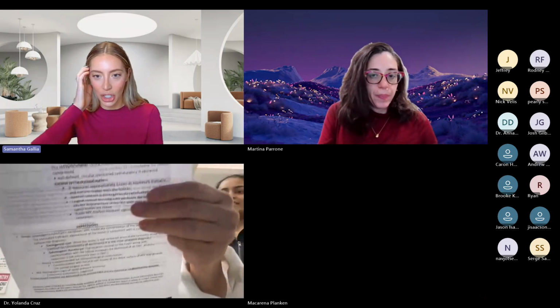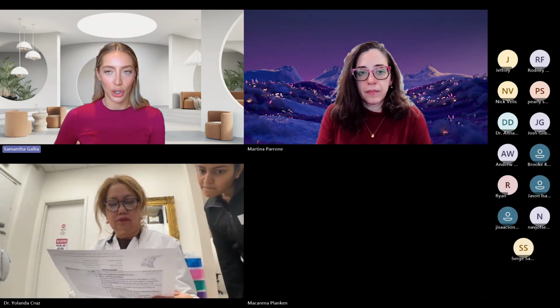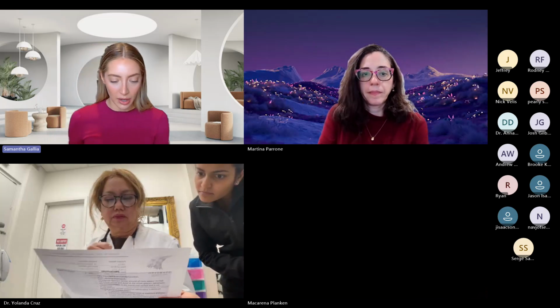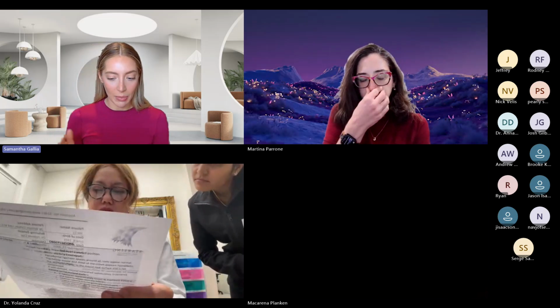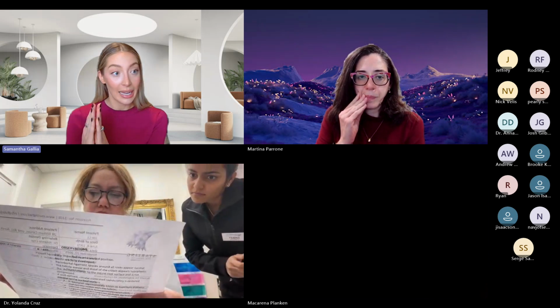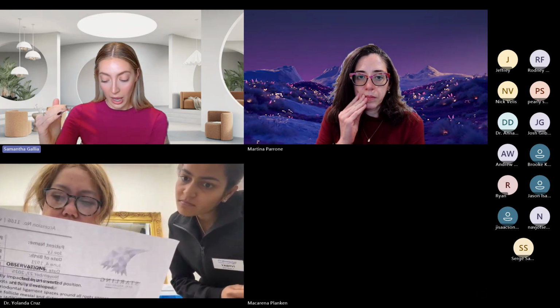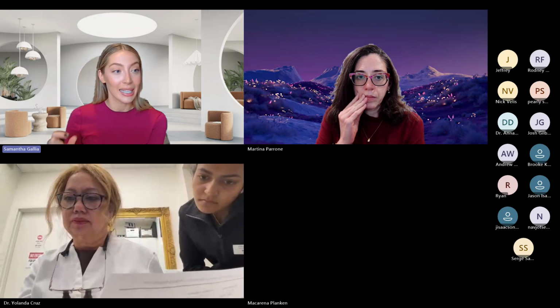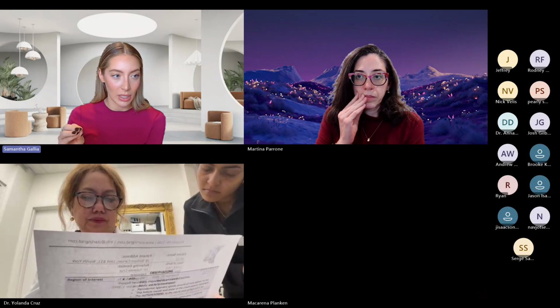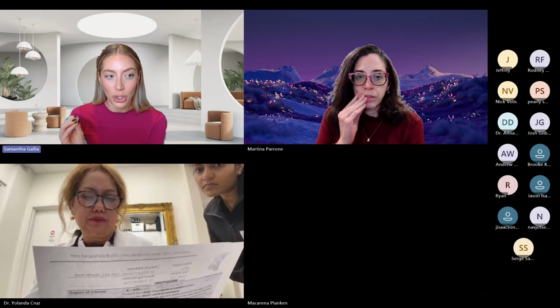Yeah, I can bring up maybe a case for that in the future, but just a little refresher plus a little more knowledge. Because of partial volume averaging artifact, if there's two densities within the same pixel of an image, you sometimes can't tell if that object is present, because it's going to change the appearance of it on a CBCT. But when we're talking about that, we're talking about super, super, super thin things.